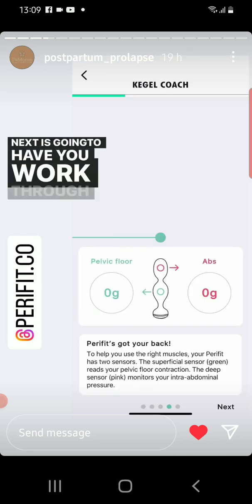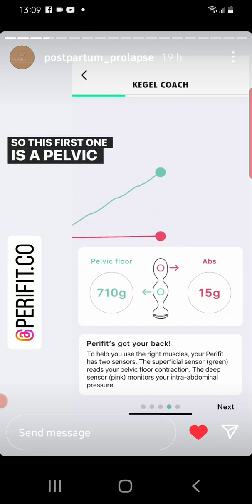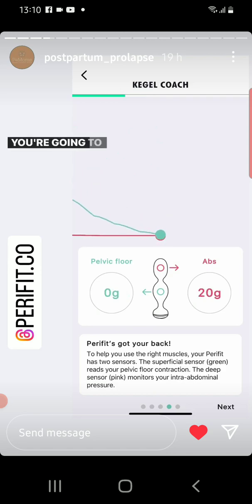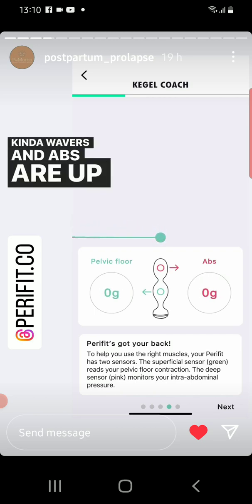Next it's going to have you work through isolating your pelvic floor versus your intra-abdominal pressure. So this first one is a pelvic floor contraction — pelvic floor values are high, abs are low. You're going to get some abs, it's not going to be zero. This one's me bearing down — notice that my pelvic floor doesn't get very high, kind of wavers, and abs are up pretty high.